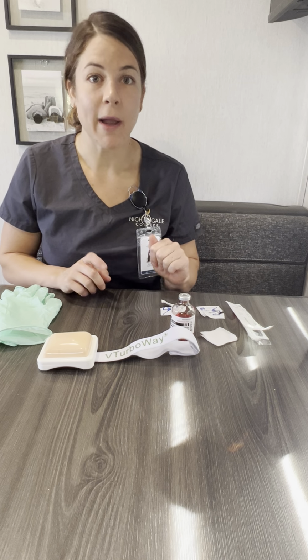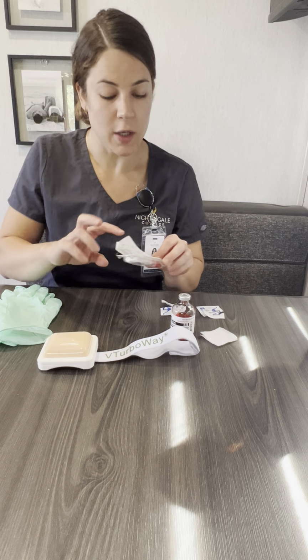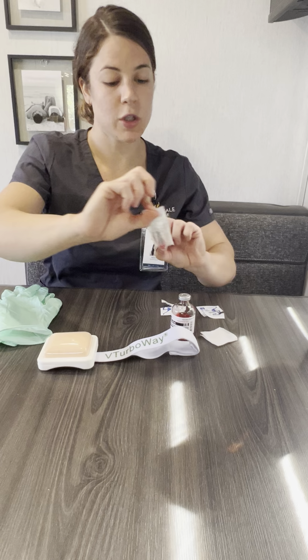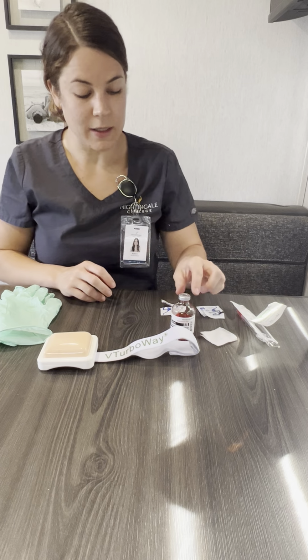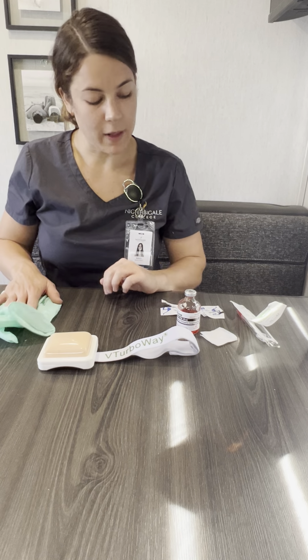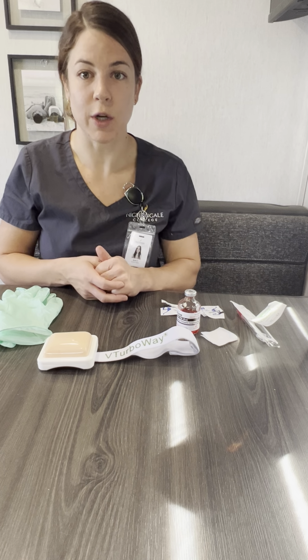When I'm gathering my supplies, I need to make sure I'm selecting the correct syringe. So it's going to be a 1 milliliter tuberculin syringe with a 5/8 needle on the end. And then I need to make sure I have the right medication, which is my tuberculin. I have gloves, 2 cotton swabs, and a gauze for after administering.